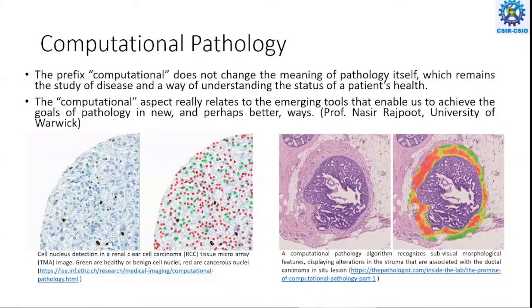So that is why computational pathology is now being used across the world, and people are using different kinds of image processing and machine learning tools to score these kinds of samples and assist the pathologist in giving the final score. A machine can never give the final score that is used in the reporting. Otherwise, it cannot be used.